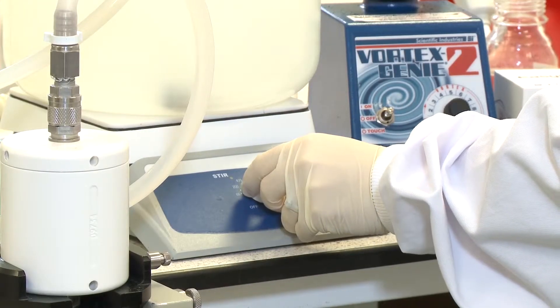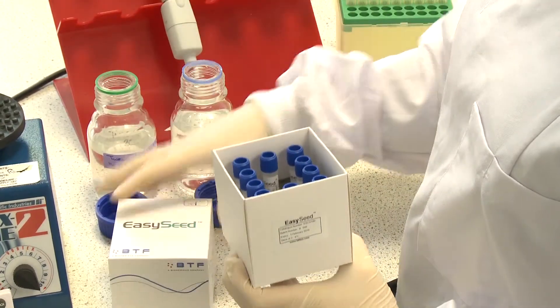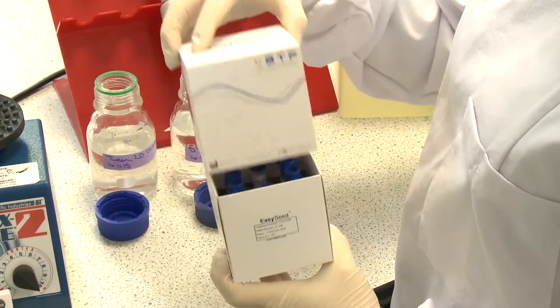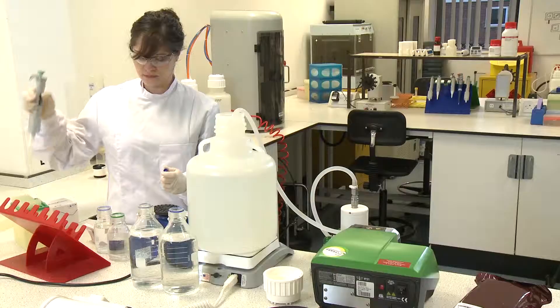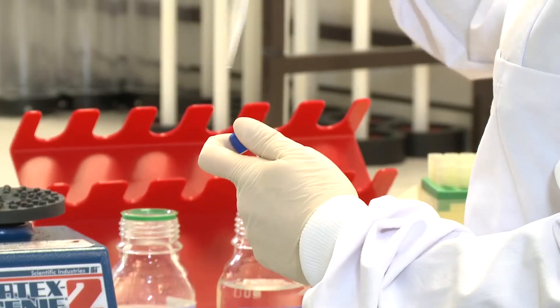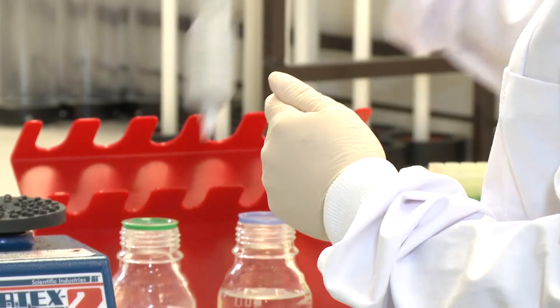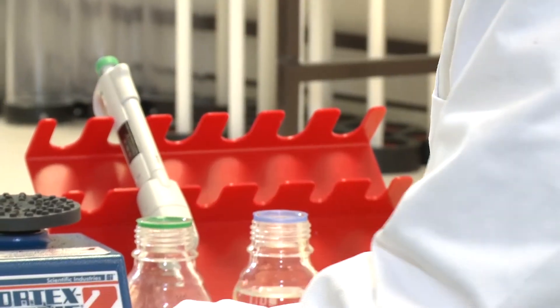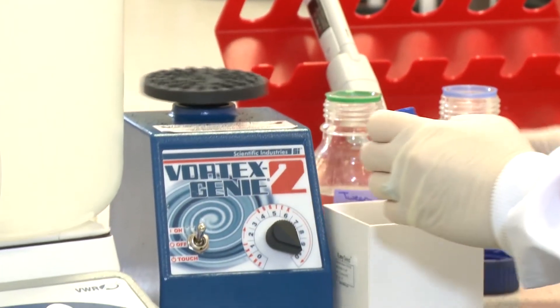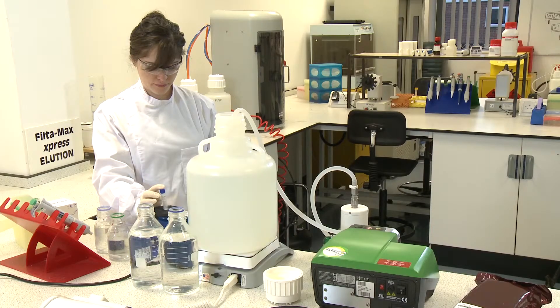Turn the stirrer plate on to mix the sample at 200 rpm. Then introduce the spike dose to the water sample, making sure that the spike has been removed from the refrigerator 30 minutes prior to use. Take one vial and add 2 millilitres of 0.05% Tween 20 to the vial. Vortex the vial at full speed for 1 minute and decant into the carboy.